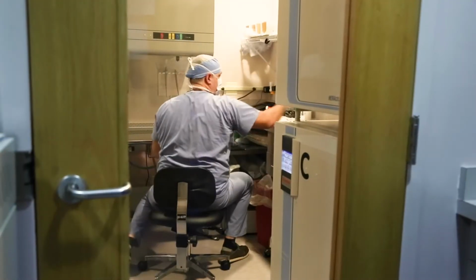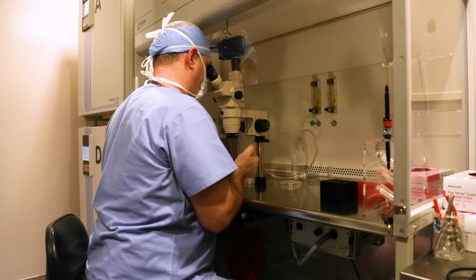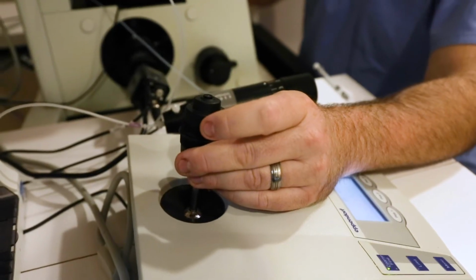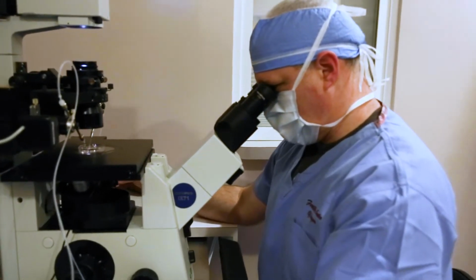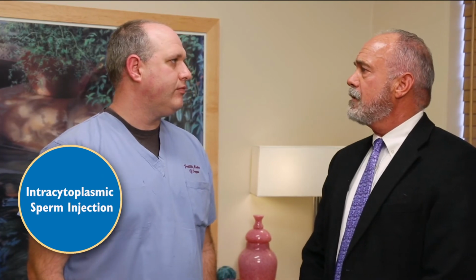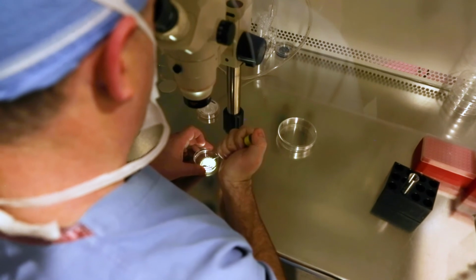And how do you determine what is a mature egg? Under the microscope? Under the microscope, we can see if there is a polar body in the oocyte, which is just a bleb of genetic material that has been extruded from the cytoplasm. If that is present, we will then do ICSI on the oocyte. I understand at times that you actually have to physically deliver the sperm to the eggs through the ICSI or intracytoplasmic sperm injection technique. Yes, the sperm that are not as motile or progressive as we would like, we have to immobilize those sperm and we put them into a needle and inject them into the cytoplasm of the egg.